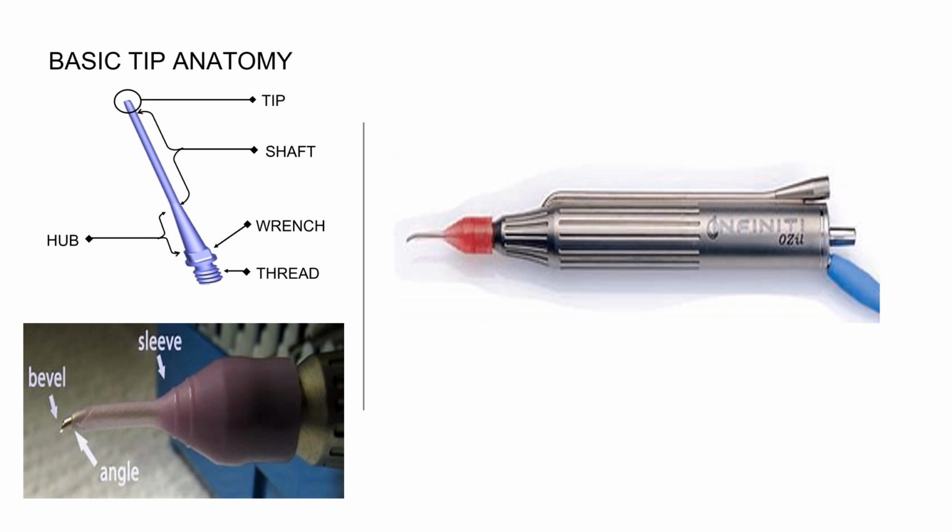To balance it, irrigation flow through the irrigation sleeves is important, which is determined by the bottle height. Remember, we covered that in part 1. So the higher the bottle height, the more the irrigation pressure into the eye, and you will need more irrigation pressure when your aspiration flow is more from the eye, and aspiration flow is more when you set the aspiration flow rate, AFR, the pump speed, at a higher rate.